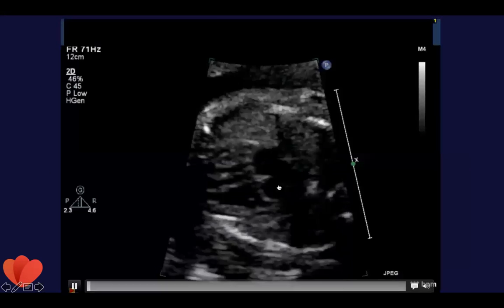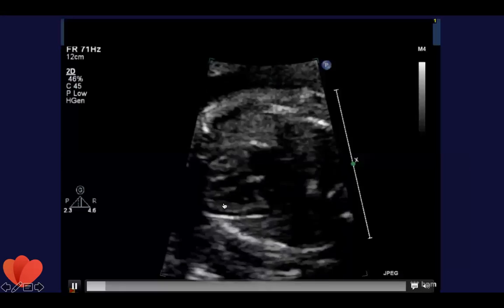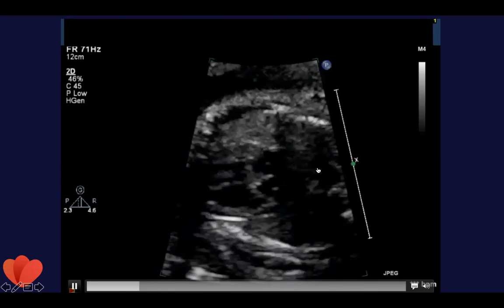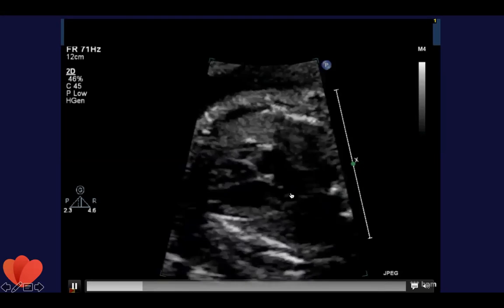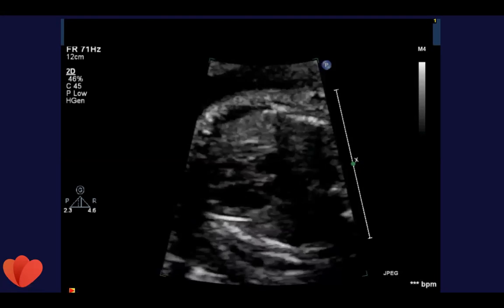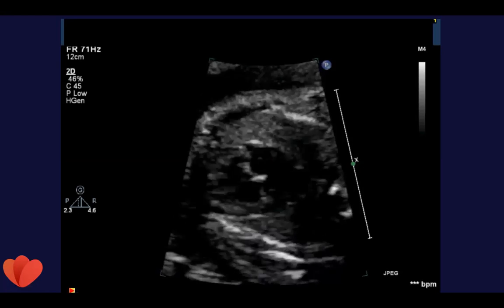So here you can see, again, the 4-chamber looks great, really liking it. And then we sweep up and you're like, ooh, what is this big vessel here? And you don't see a pulmonary. So you're like, oh, I just see one vessel. I see a hole between the bottom chambers and one big vessel. Truncus arteriosus is very high on my list.